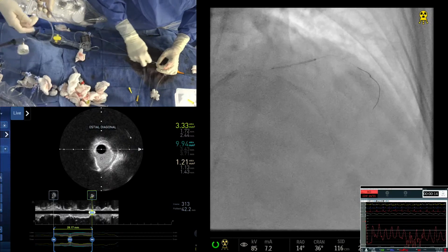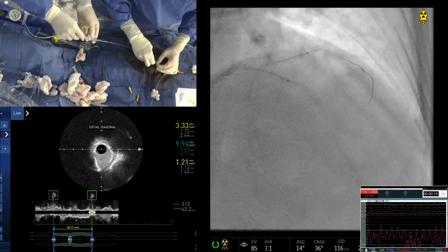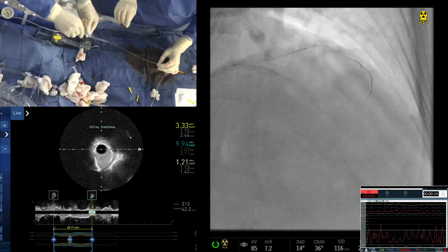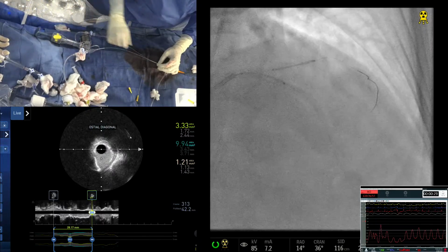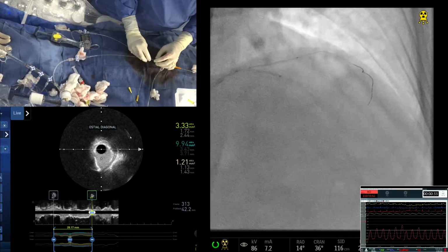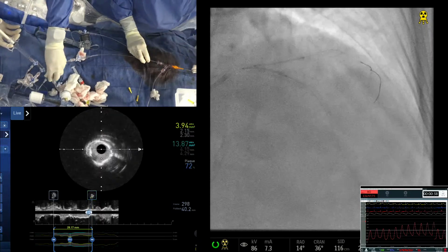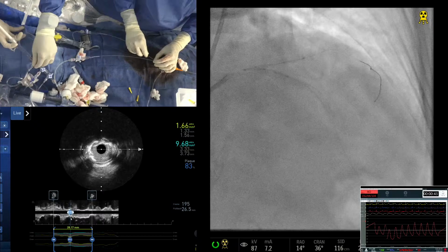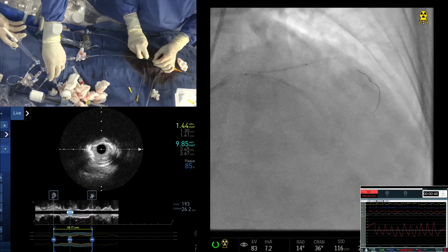Now, the question is, if you know that a small amount of particle has been left, I would say very simple: in that particular case, make sure you exclude that plastic material by putting a stent, so that it does not cause any inflammatory reactions. But plastic, as you know, is now found in a lot of plaque. They have shown the plastic has gone into the atherosclerotic plaques very commonly. Microplastics, yeah. Nanoparticles, yeah.